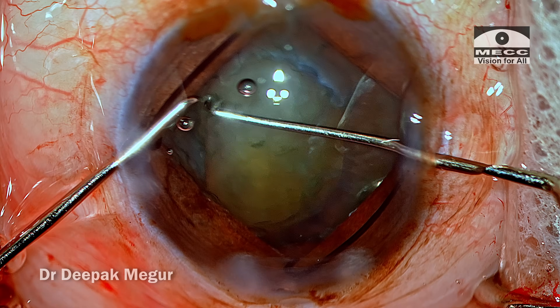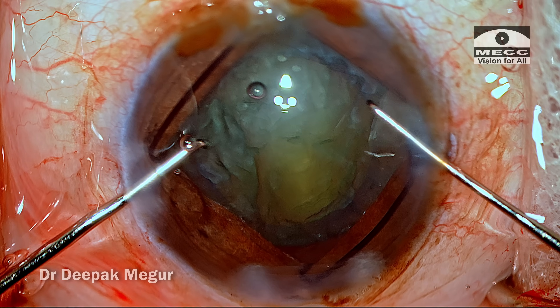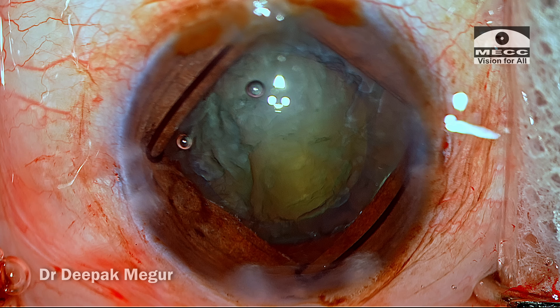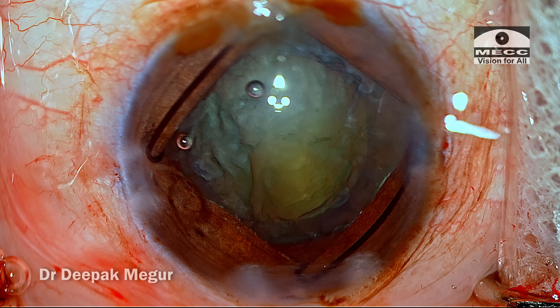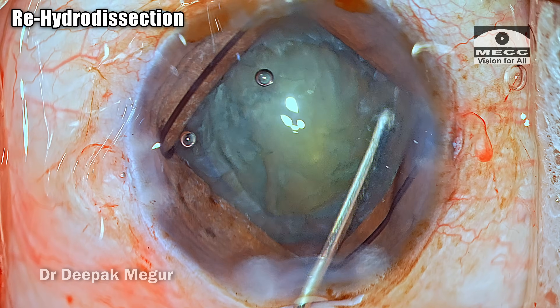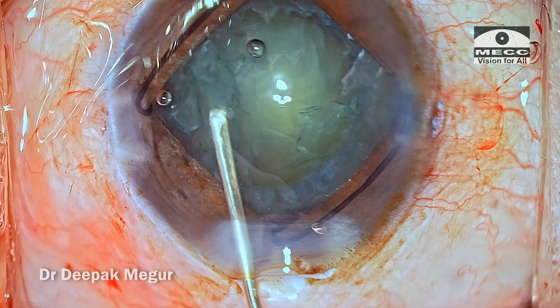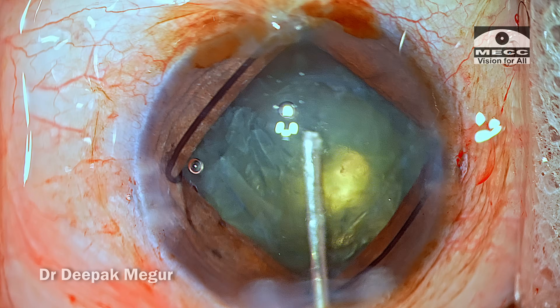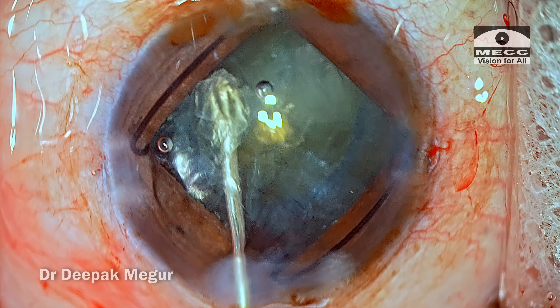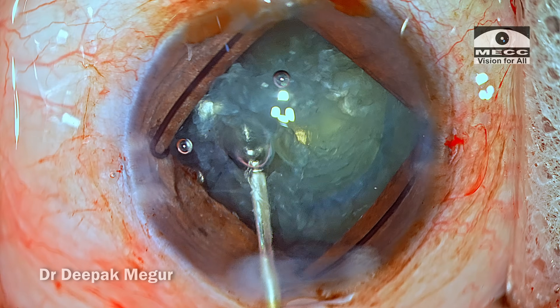Slowly but surely, the ring is negotiated under the rhexis margin and now I'm certain it's stabilizing the equator of the capsular bag pretty well. Once the ring is in place, it's always a good idea to repeat hydrodissection. Now with the capsular bag being stretched by the ring, there is a greater chance of hydrodissection being much more efficient in dissecting out all the corticocapsular adhesions. I go ahead and repeat hydrodissection, decompress the bag, and now is the time to manage the nucleus.